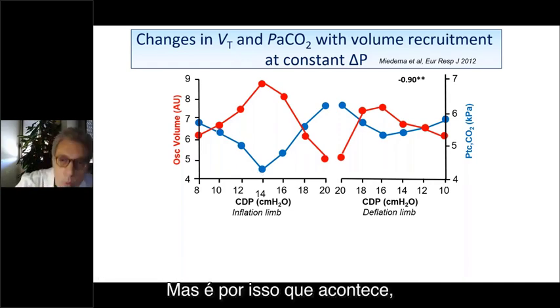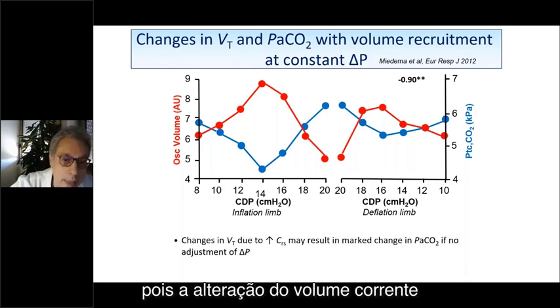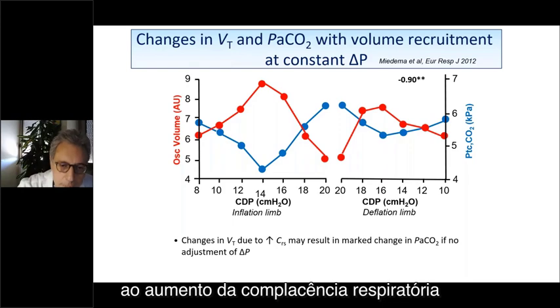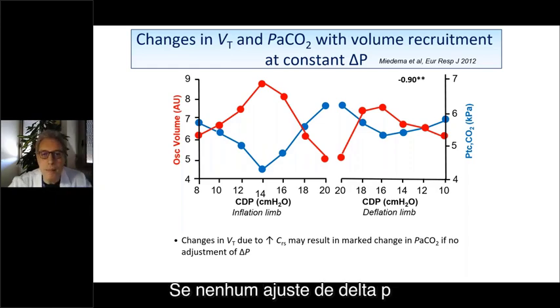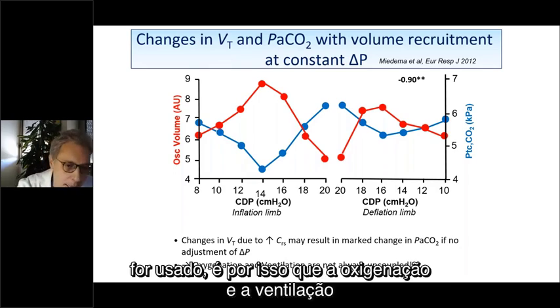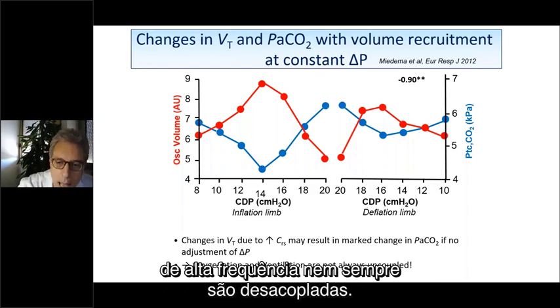But this is why it happens. It happens because changes in tidal volume occur during the recruitment maneuver secondary to the increase in respiratory compliance, and that is responsible for the marked change in PaCO2 if no adjustment of delta P is used. And this is why oxygenation and ventilation, also during high frequency ventilation, are not always uncoupled.